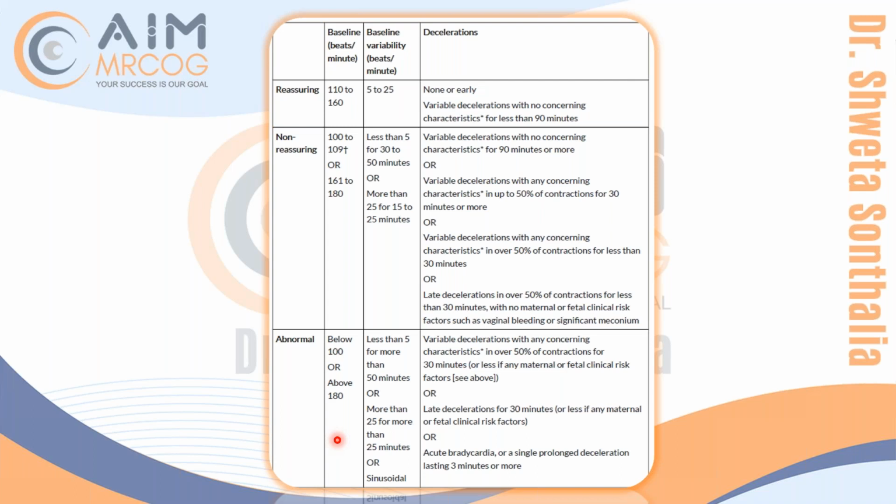The sleep cycle. Yes. Very good. Because the maximum baby sleeping pattern, they say that cycling of CTG. Here it's a very common word, cycling. Cycling of CTG means in between less variability, in between good variability. So that is cycling. Cycling means in between the baby sleeping.